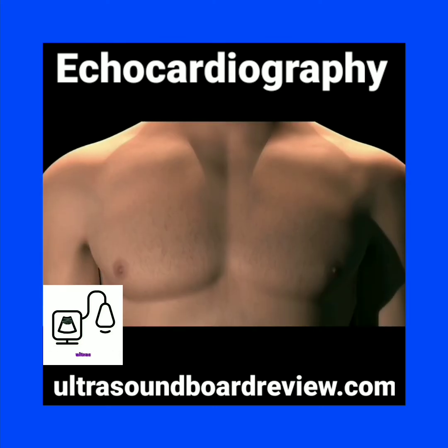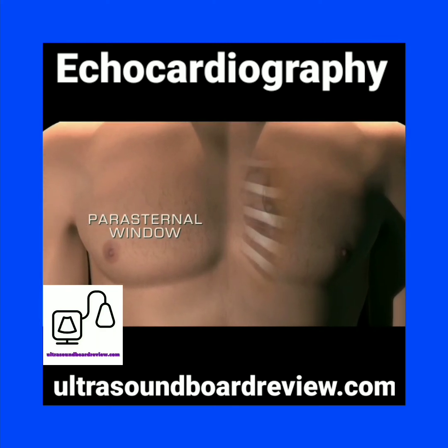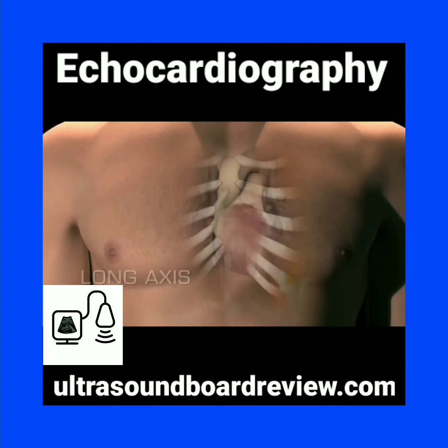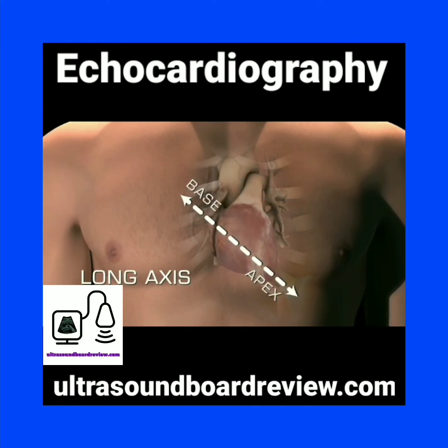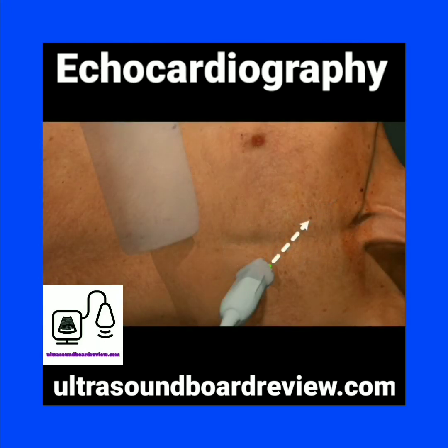The parasternal window is commonly the starting point for obtaining views of the heart. Start scanning in the left parasternal region, just lateral to the sternum from the 2nd to the 5th intercostal spaces. The goal is to align the transducer beam with the long axis of the heart. The probe marker should be oriented toward the patient's right shoulder. While scanning, the image can be improved by slight rotation and tilt of the probe.